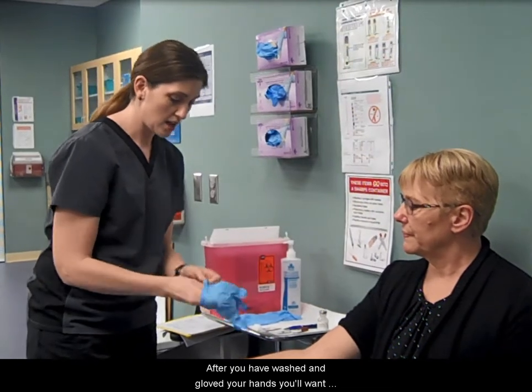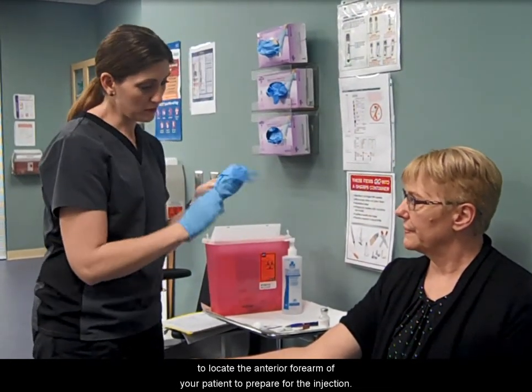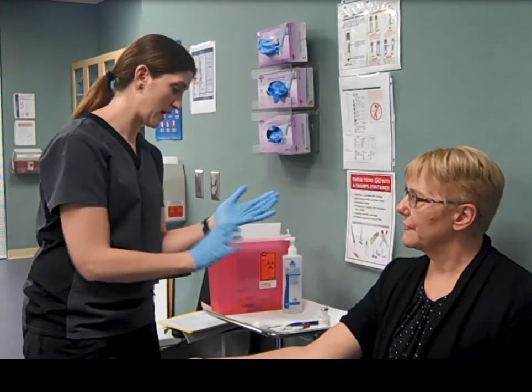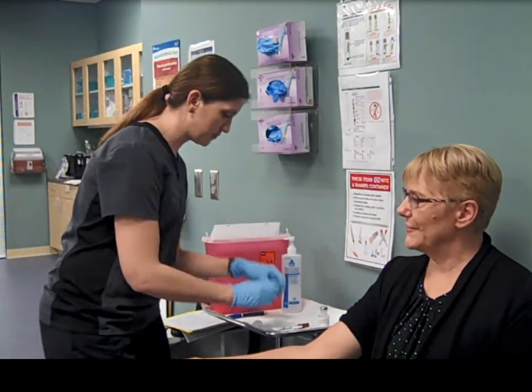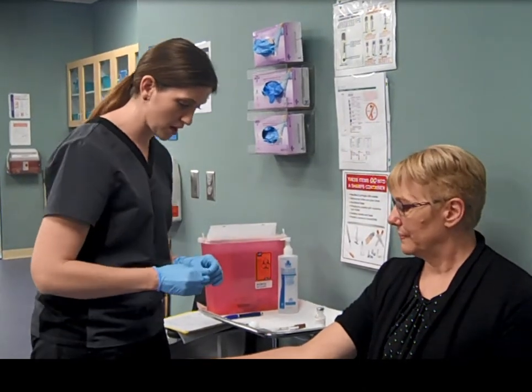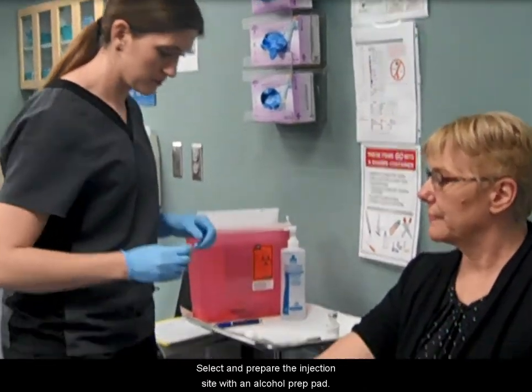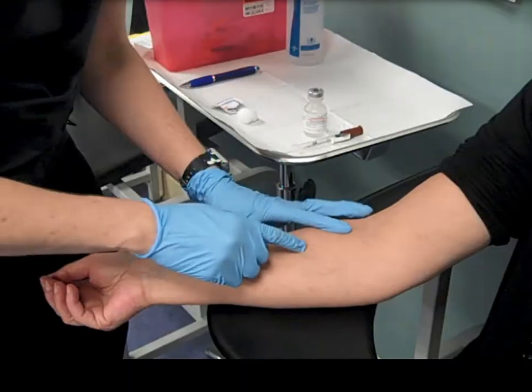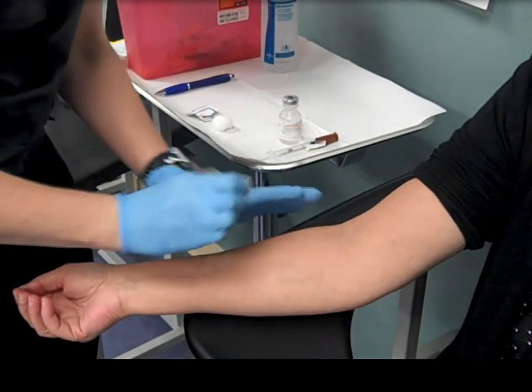After you have washed and gloved your hands, you'll want to locate the anterior forearm of your patient to prepare for the injection. Select and prepare the injection site with an alcohol prep pad. Allow the alcohol to air-dry.